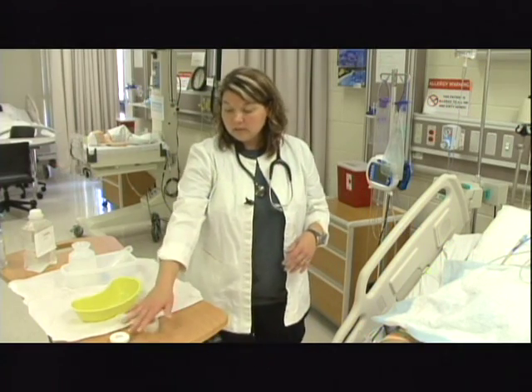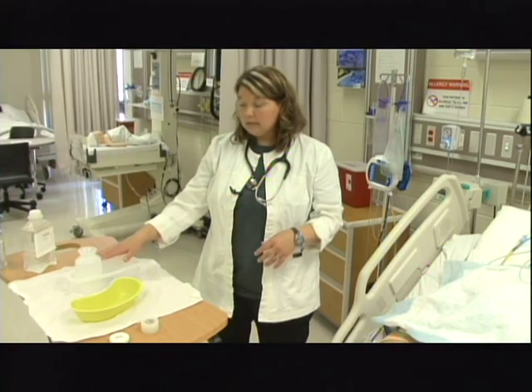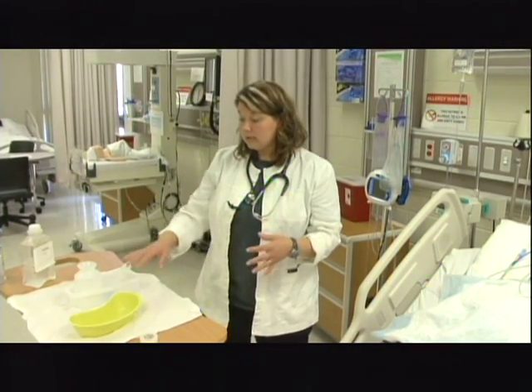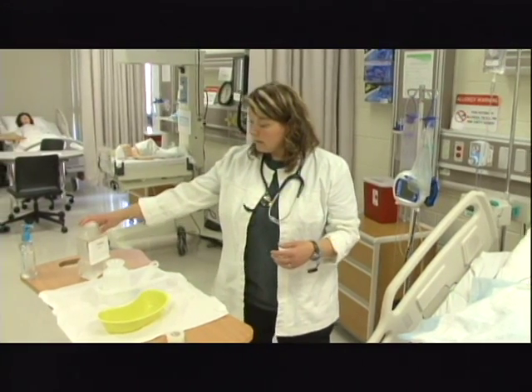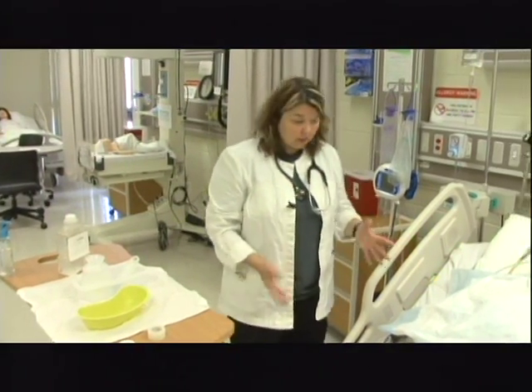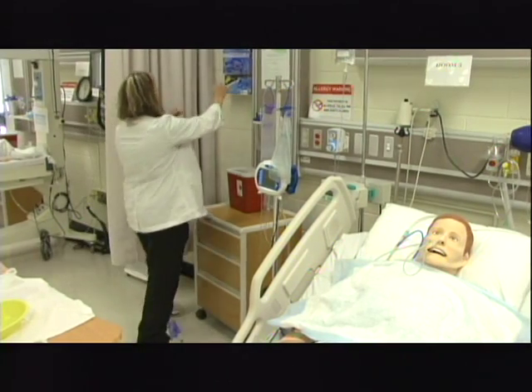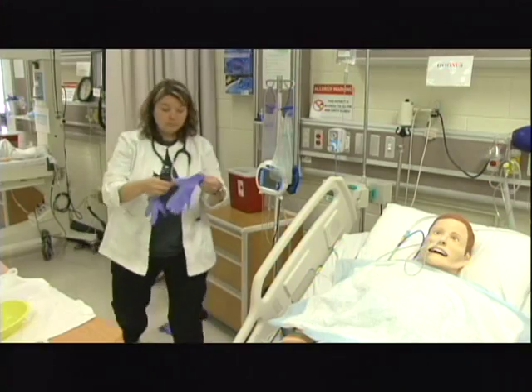So I certainly need something to measure it with, some pH paper. I need my piston irrigation set. Again, if it's already been in the room, I need to make sure that it's within the expiration date, and this one is date, time, and initialed, and it's within it. I need whatever the ordered irrigant is, okay? And then I need to make sure that everything is where I need it and all that stuff. I'm going to go ahead and get me some clean gloves because this, again, is not a sterile procedure. I've already foamed in whenever I entered the room.